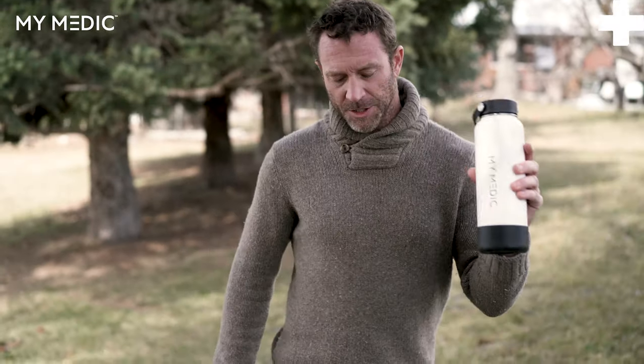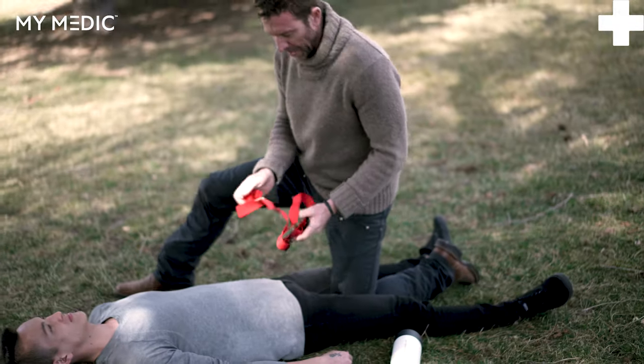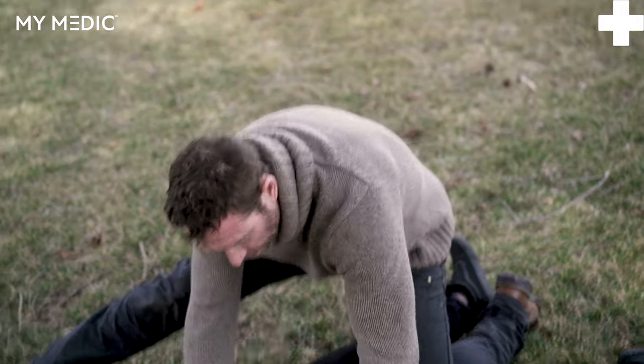I'm going to show you guys how to make an improvised junctional tourniquet using a rigid water bottle and a soft tee tourniquet. You might run into a case where you have a wound that's so high up into the pelvis that you can't get a tourniquet on it. Here's an improvised way you can stop that arterial bleed.